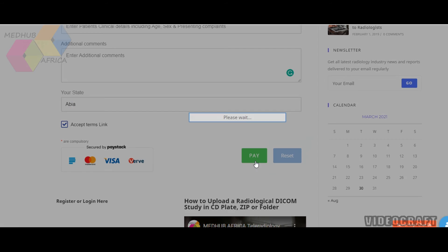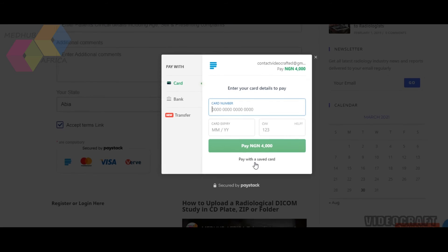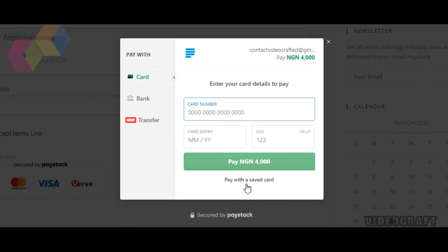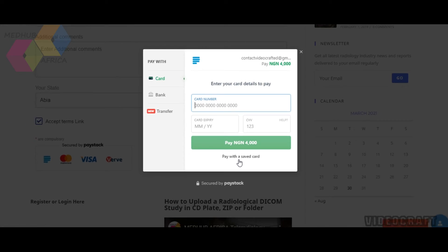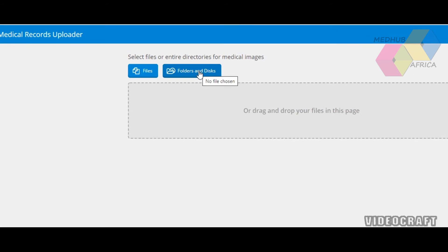When you are done, click on Pay. You will be redirected to Paystack to complete your payment using either your card, your bank, or bank transfer. Input your card details — it is safe and secure through Paystack. Complete the payment and you will be redirected to the upload window.